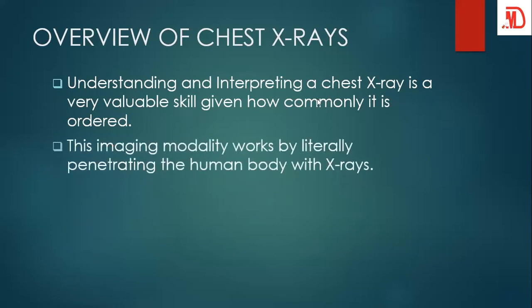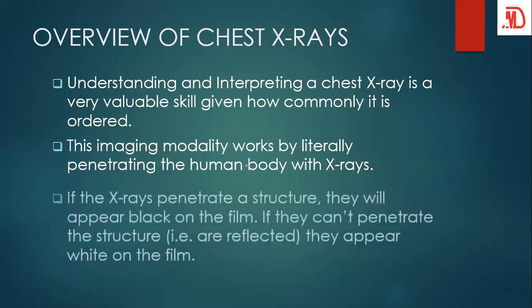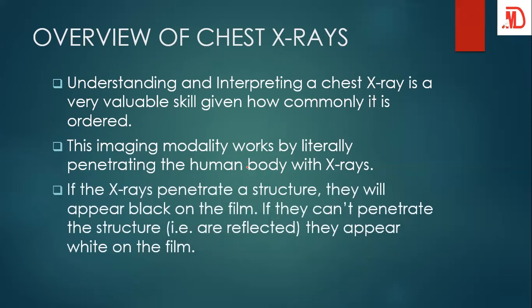Now, this imaging modality works by literally penetrating the human body with x-rays. So we just subject the person to rays of x-ray, and then we record the findings, just like the pinhole camera. I believe you remember the pinhole camera from your physics. Now, if the x-ray penetrates a structure, it will appear as black on the film, and if it cannot penetrate the structure, it is deflected, so it is reflected and appears as white on the film. So it's basic. If the x-ray cannot penetrate through it, it will be white. If it can penetrate, it is black.